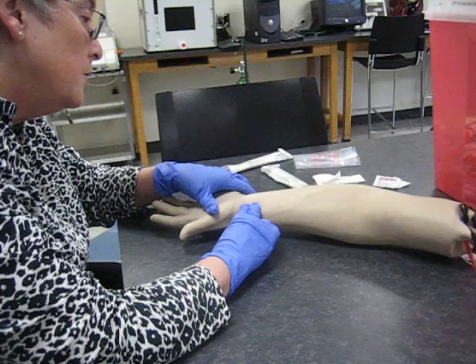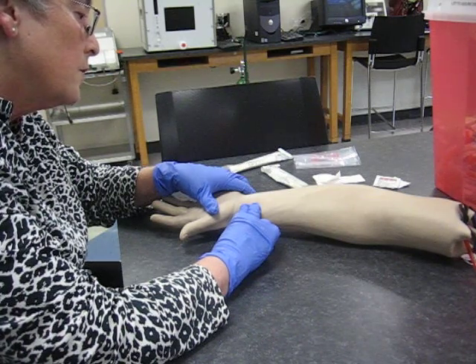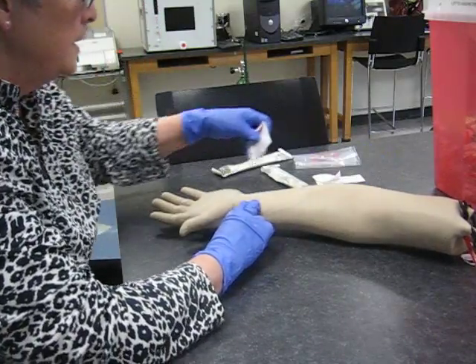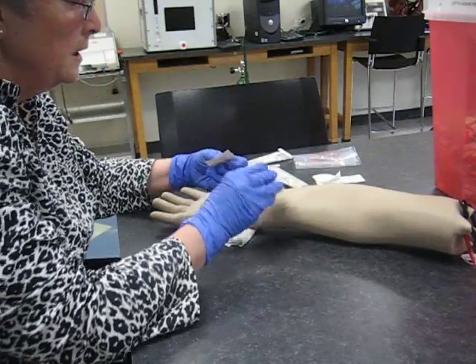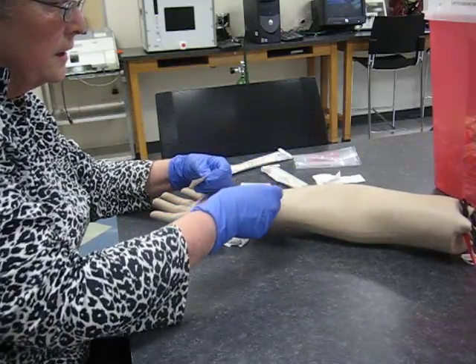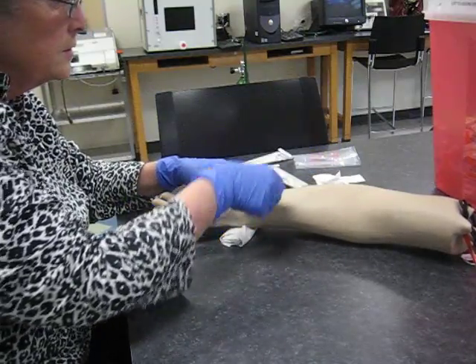Mr. Hand, I forgot to ask you — are you allergic to shellfish? Are you allergic to iodine? Good. I'm going to clean you up with some alcohol and some iodine, and this is going to be a stick here in a little bit. I do the iodine center-out, and I'll go back over it, alcohol center-out.